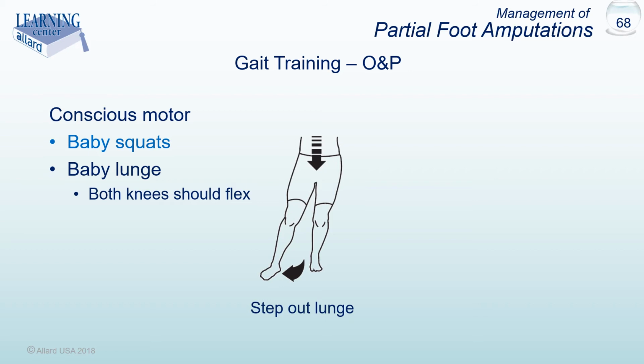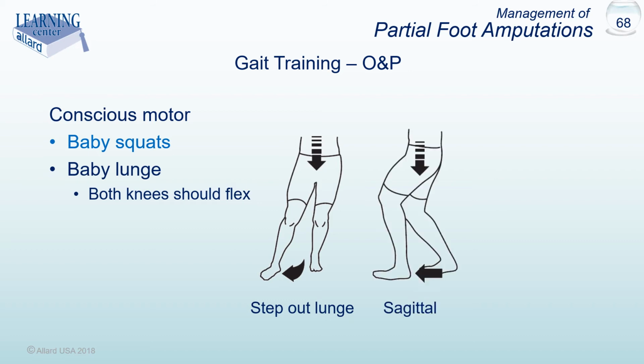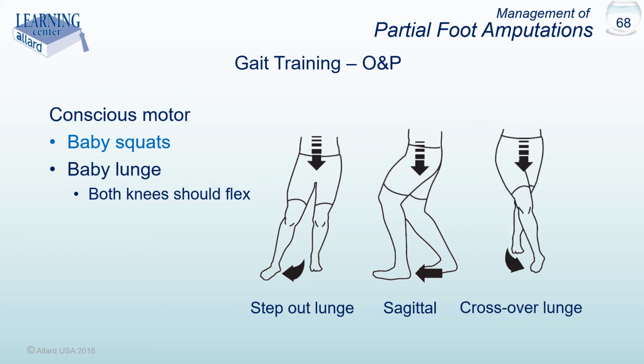Next, have your patients do a series of lunges. Start with stepping to the side, leading with the involved side, making sure both knees are bent. Then repeat the process with stepping straight ahead. And a third time with crossover steps. These maneuvers will help them adapt to walking straight ahead and with turning left and right. Repeat the process, leading with the sound side.